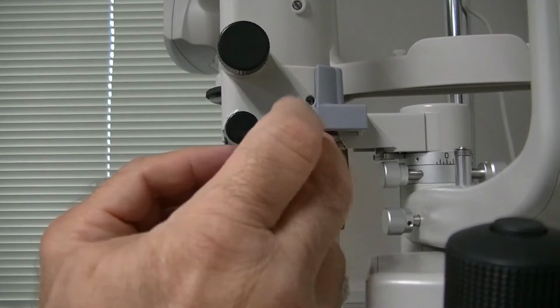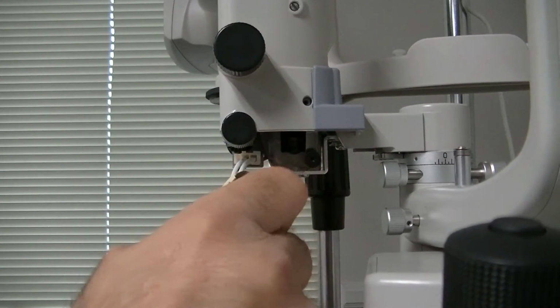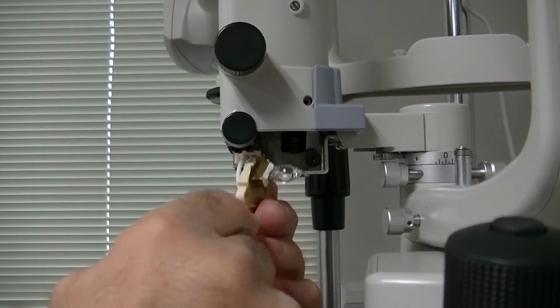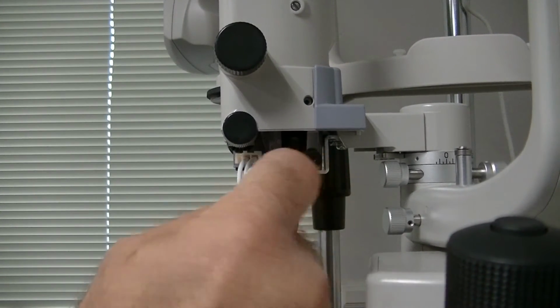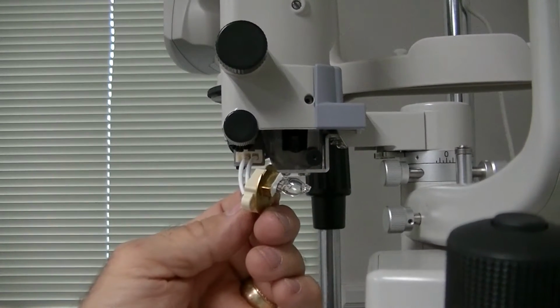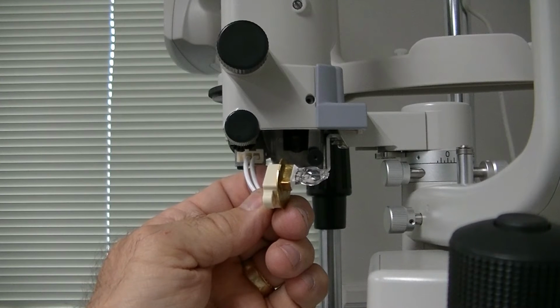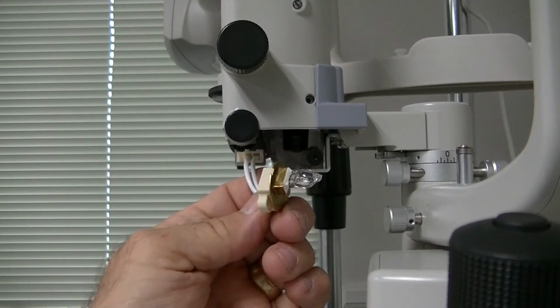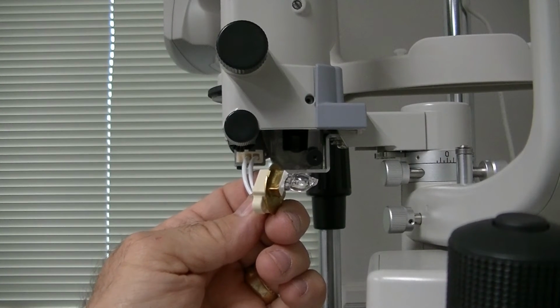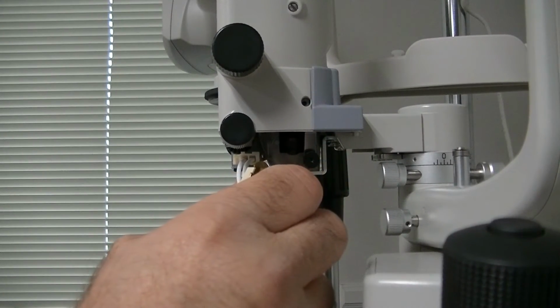Now, if you touch this glass part with your hands, take an alcohol swab before you put it back into the slit lamp, because if you don't, the oil from your hands will go on this bulb, and the heat that the bulb produces will not dissipate properly, because it'll go right where the oil is and it won't allow the glass to dissipate the heat properly, and the bulb will blow out very quickly. So just simply take an alcohol swab and wipe it off, let it dry for a few seconds.